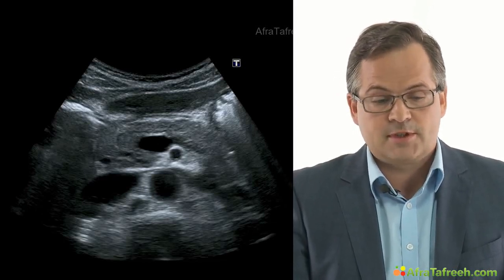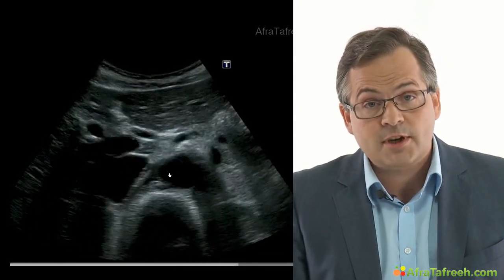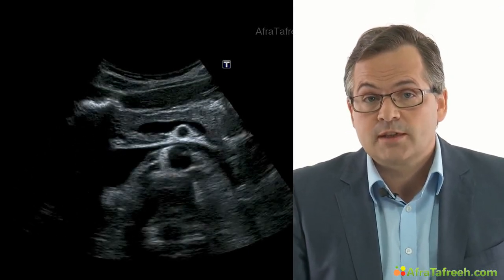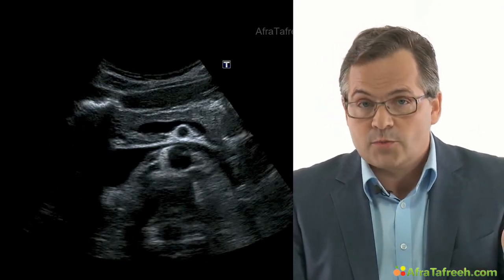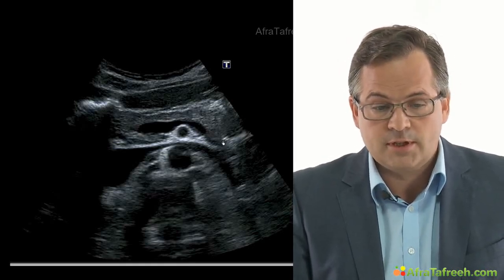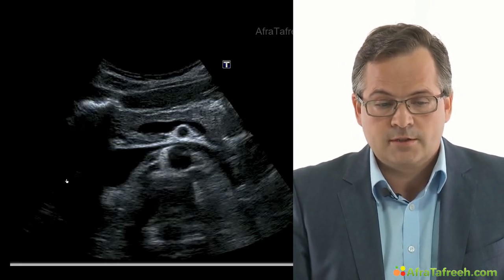and superior mesenteric artery. Once again, the splenic vein, it's a really important structure in the abdomen of the patient because we can locate the pancreas. When we found the splenic vein, we know pancreas is located anterior to the splenic vein. And again, we see over here splenic vein, renal vein, aorta, spine.